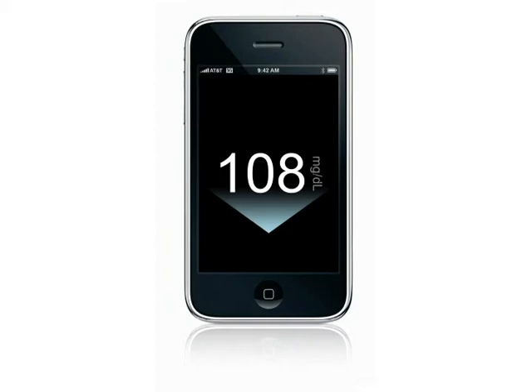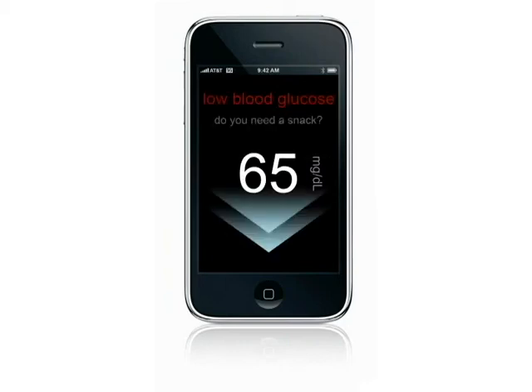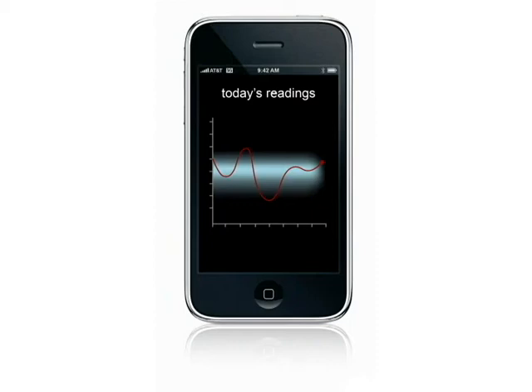Every 5 minutes your glucose level is sent to the iPhone where the user can discreetly view it. Trend arrows show whether glucose levels are moving down or up, and rapid changes are indicated by double arrows. An audible alarm will sound if the user's blood sugar drops below 70 milligrams per deciliter or above 200. Previous readings can be viewed in a graphical format as well as uploaded to the user's doctor's office.